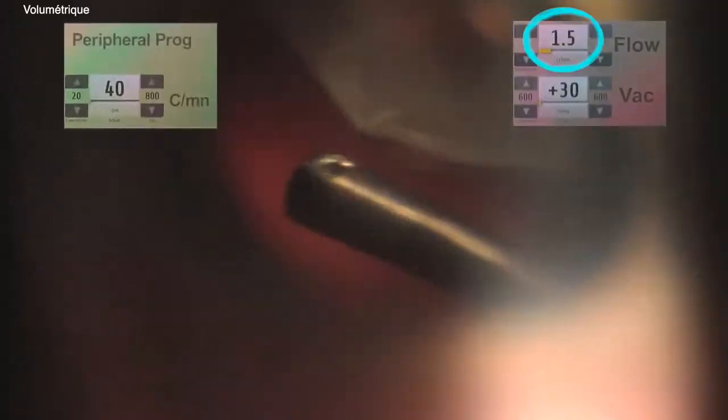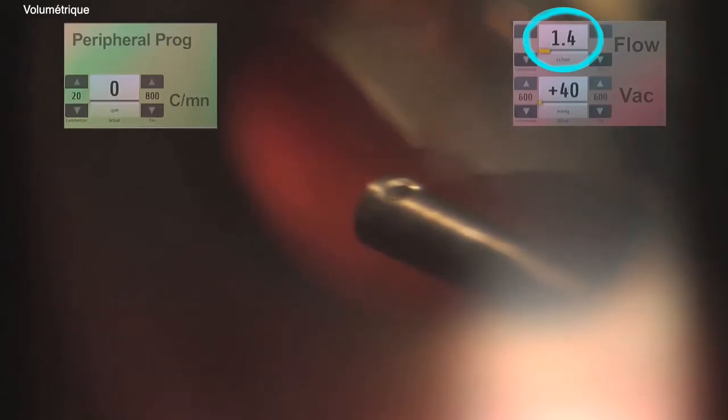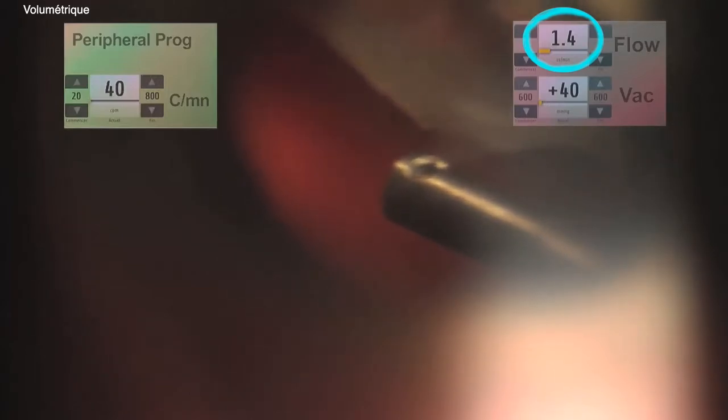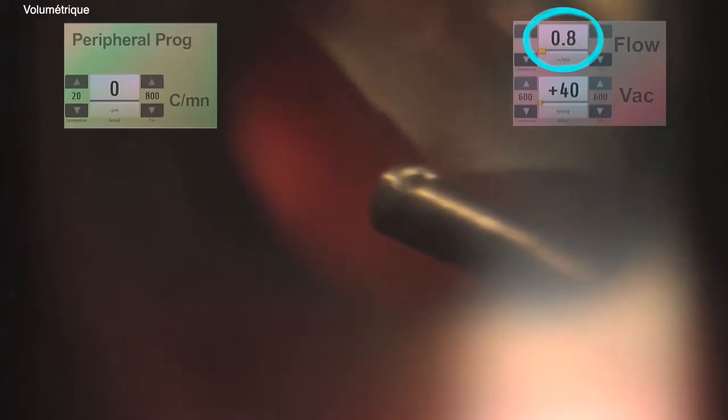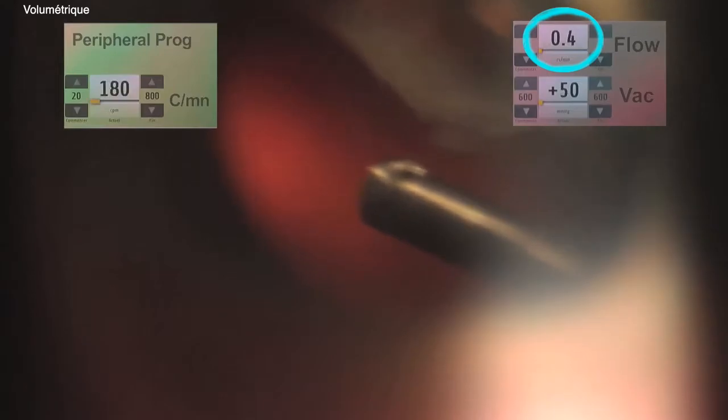Finally, the operator will tackle the most precise work to remove the adherent posterior hyaloid and the last small vitreous adherent fibers at the vitreous base. If he uses a flow control machine, he will select flow rates of half a cc, 1 cc, or even 1.5 cc with a foot pedal to safely engage the posterior hyaloid for peeling, or to engage at the base the small vitreous adherent fibers before cutting them flush with the retina.